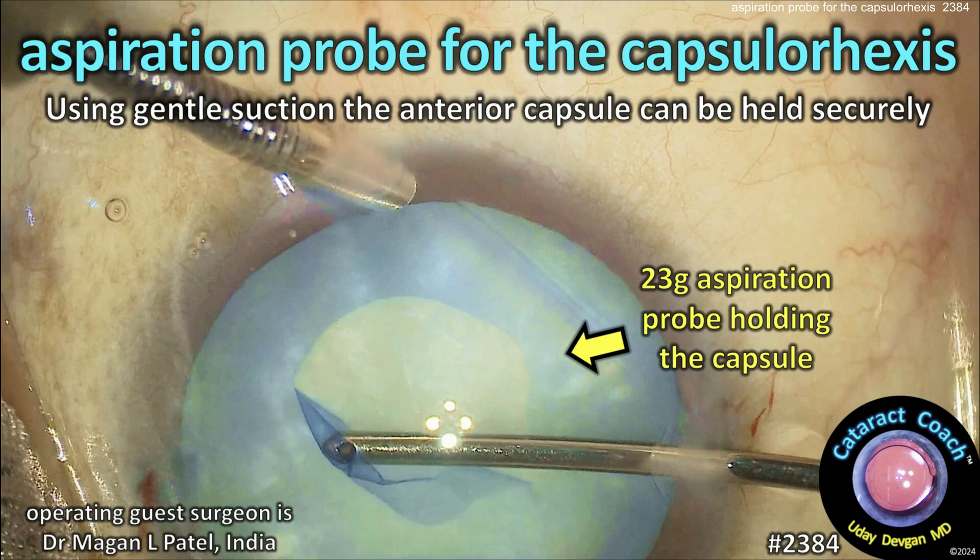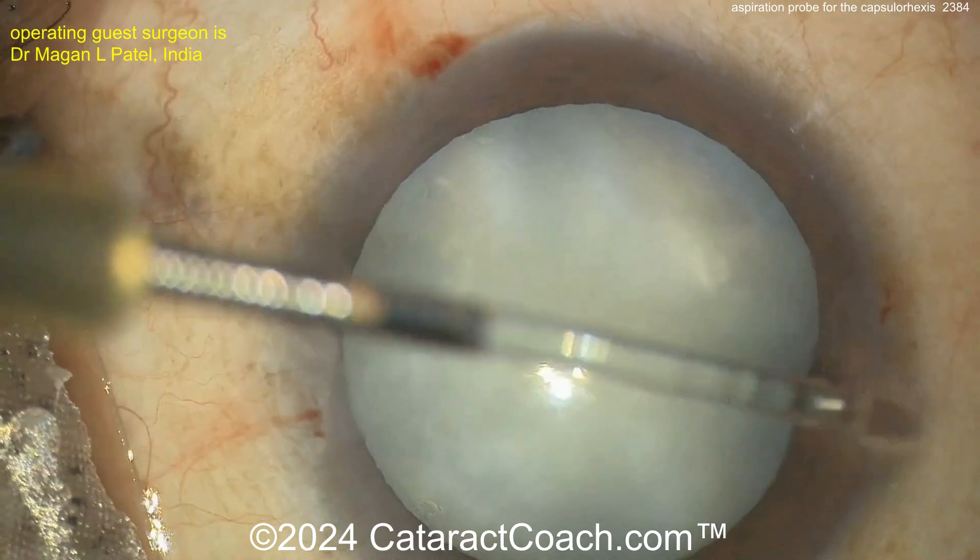CataractCoach.com. Aspiration probe for the capsular rhexis. You can use gentle suction on the anterior lens capsule and hold it securely.